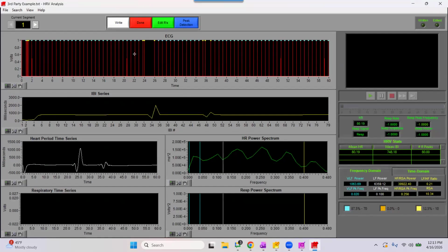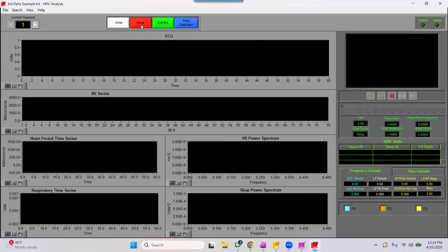We don't have any precision around the systolic peaks. And so in order to get that millisecond timing difference to assess arterial stiffness, we simply just aren't using a device that supports the type of question we're asking. So that being said, something to consider here when thinking about your devices and making sure what data access you have, but then also considering those proprietary algorithms and raw data access.